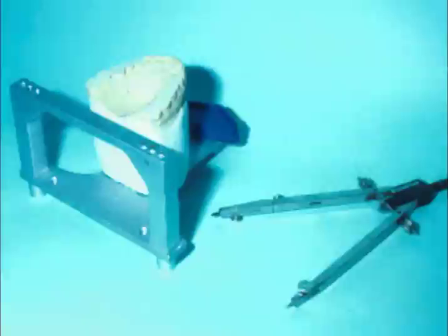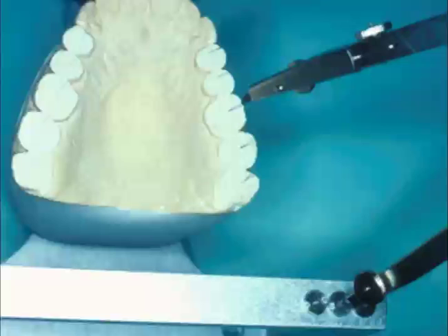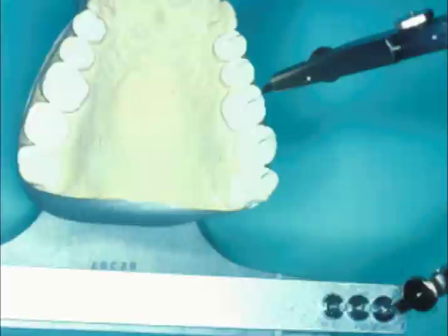So he took a set of models and ground down the teeth to make a writing surface and mounted them into an articulator that had a small, medium, and large intercondylar distance. Then he took a compass and started at the center of the tooth at the small intercondylar distance and drew the first line. He then indexed the compass at the medium intercondylar distance, readjusting the compass to the same starting point, drawing the second line. Then he put it at the wide intercondylar distance, readjusting the compass again to the same starting point to draw the third line.